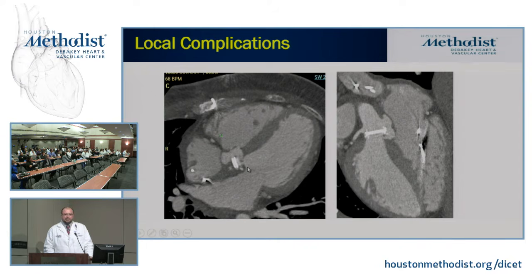We can describe anatomy, less often physiology. Although for physiology, we are inferior to echo Doppler in terms of direction of shunt and quantification, but in terms of anatomy, if you want to look at the overall picture and the overall local destruction and communication, so looking at local complications.